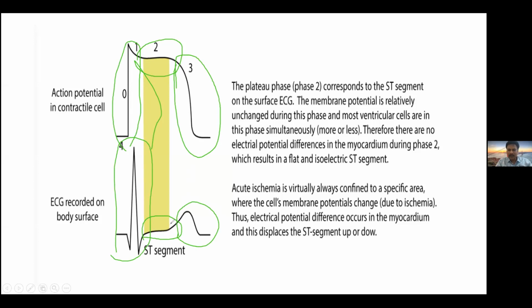the ST segment. When there is ischemia in some coronary artery territory, this ischemia disturbs this silent phase. So the ST segment is disturbed. If the epicardial territory is involved, then you have ST elevation. When there is subendocardial ischemia, there is going to be ST depression. Now you understand why ST segment elevation and ST depression happen during the silent phase.